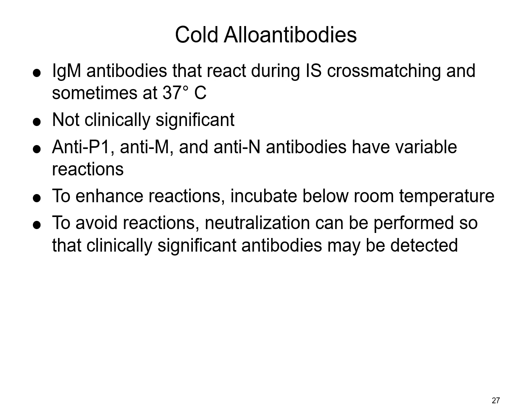To avoid reactions, neutralization can be performed so that clinically significant antibodies may be detected. So you can use some of those different techniques to help enhance those reactions.